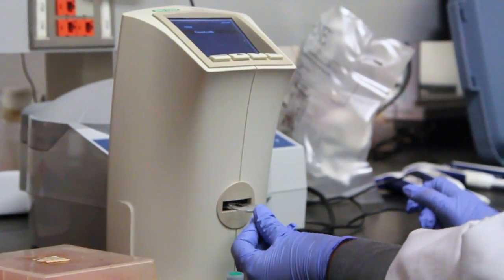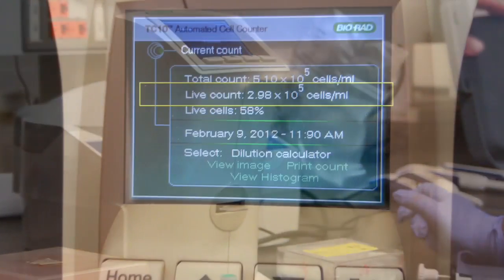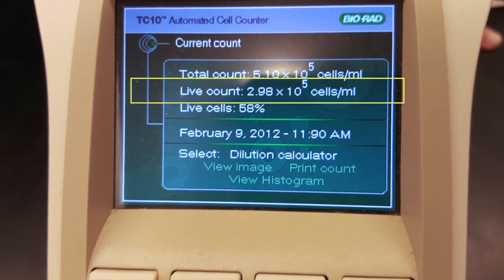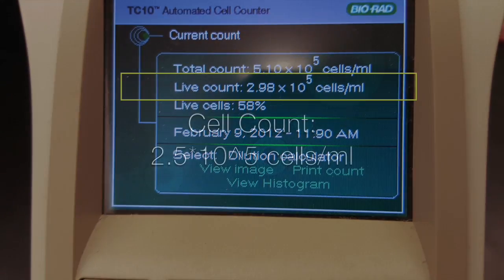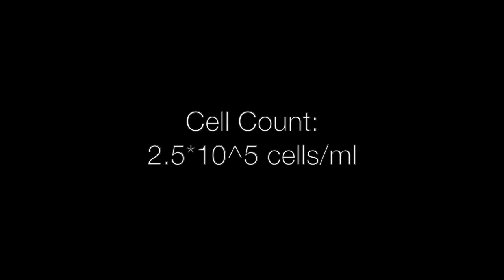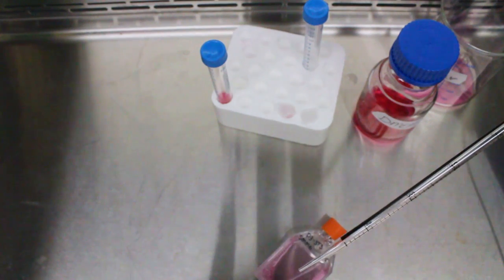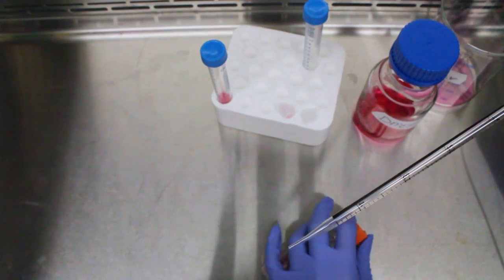Our cells revealed 2.98 times 10 to the fifth cells per milliliter, which reaches a preferred cell count of 2.5 times 10 to the fifth cells per milliliter. Therefore we will split our sample into two cryovials for preservation.